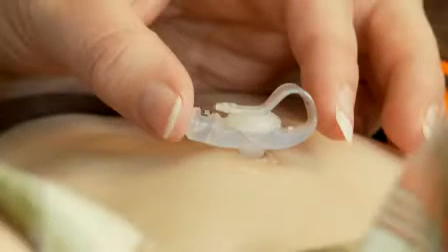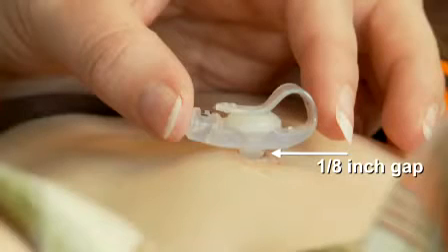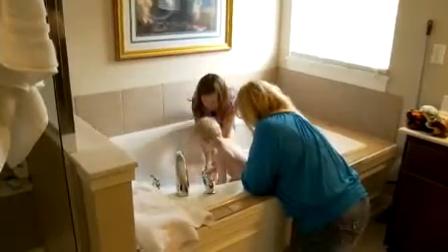The external bolster should not fit tightly against the skin, restricting movement. Instead, a 1/8 of an inch gap between the external base and the skin surface is recommended to provide room for air circulation and cleaning. Patients with buttons can swim and bathe. A good time to clean the stoma is during a bath. Let the stoma site air dry after cleaning. Check for redness, pain, swelling, or unusual drainage. Call your healthcare provider if any of these symptoms are observed.